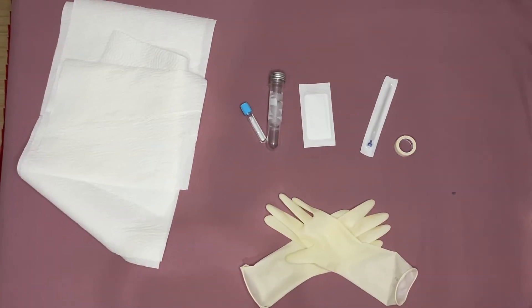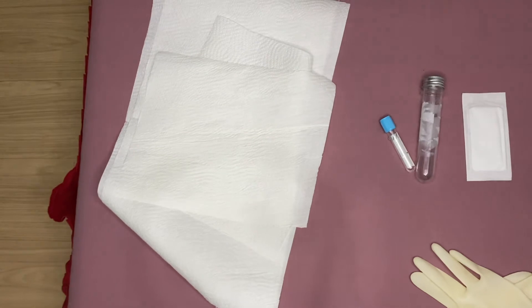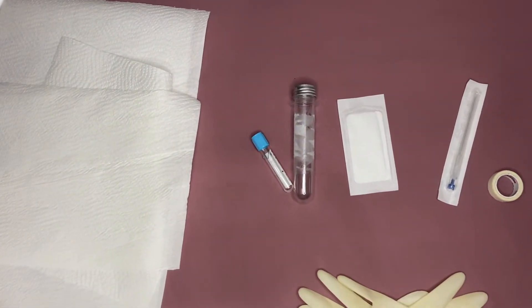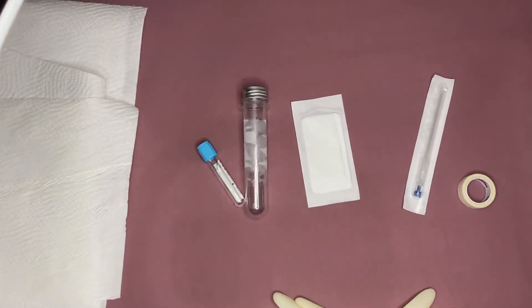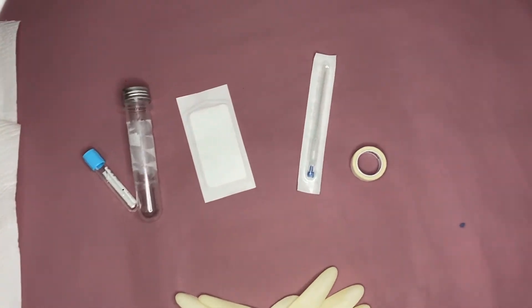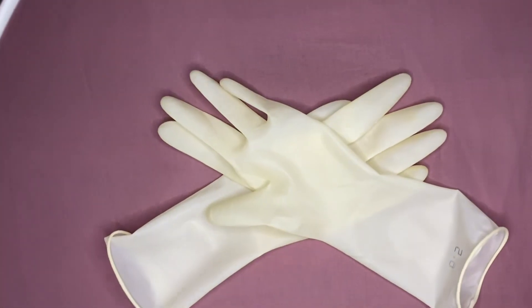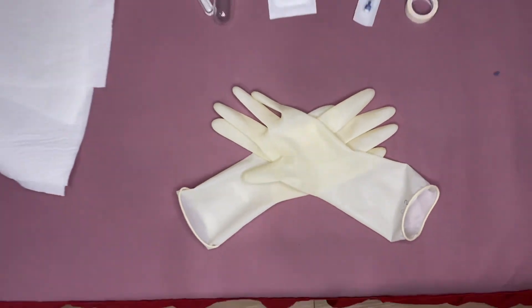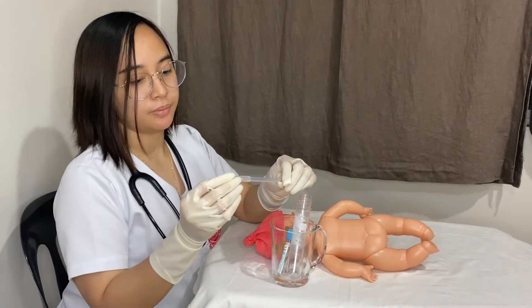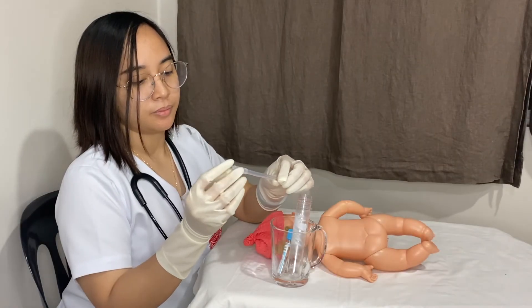Prepare the equipment such as a reusable or disposable tray, drapes, several containers, gauze, and a few basic instruments, often with tubes. Make sure that the tubes are open before you begin to facilitate filling once you have successfully obtained CSF flow. Open your needle and place it on the tray.